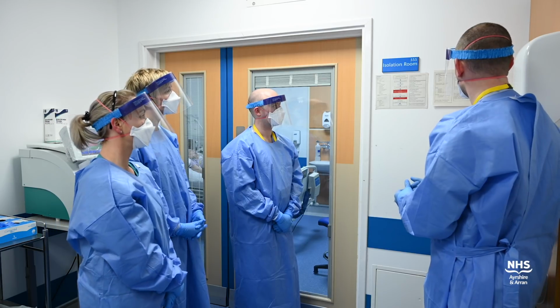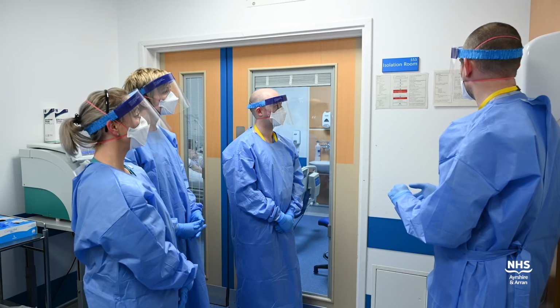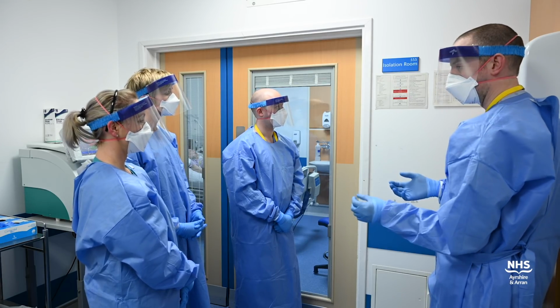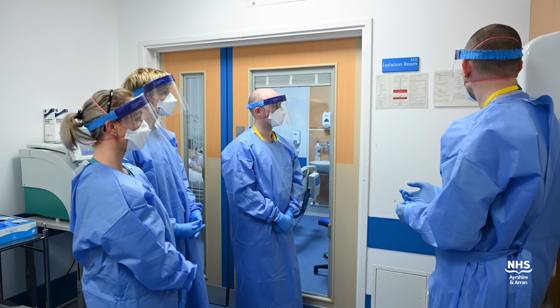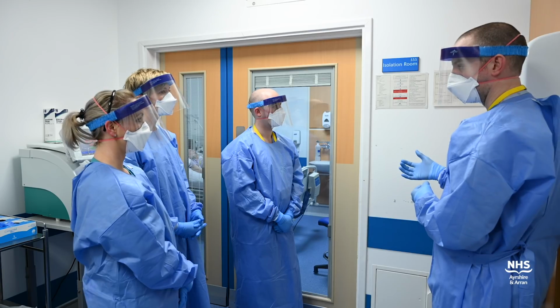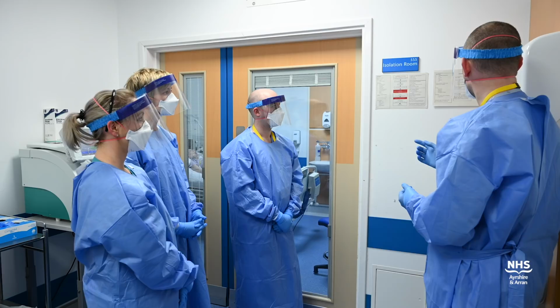Want to take in with us. We've got early rescue trolleys available. We've got drugs for intubation, sedation, and inotropes if we need them. Intubation of a patient with COVID-19 is considered an aerosol generating procedure. Therefore, all members on the team should be fully donned in PPE.